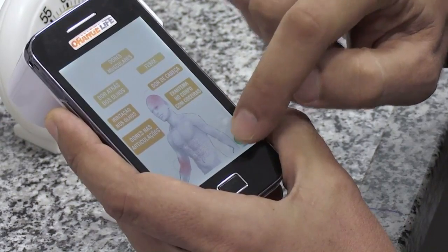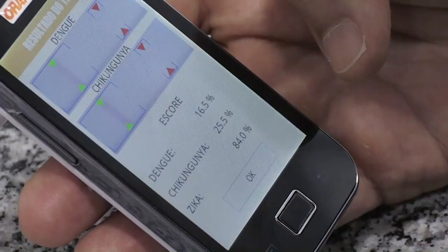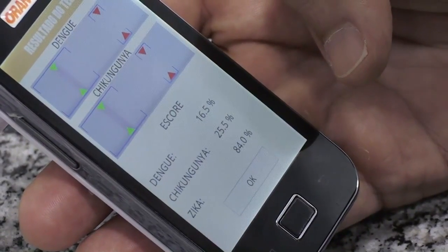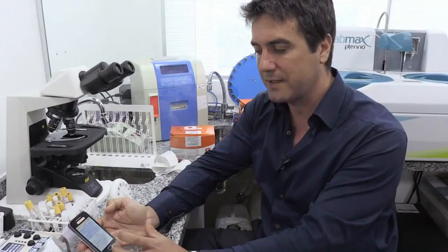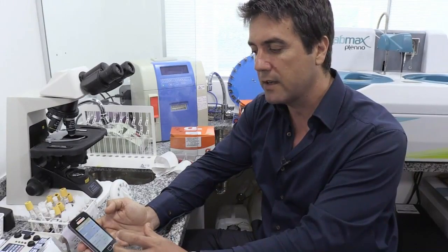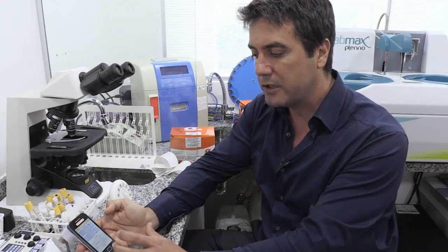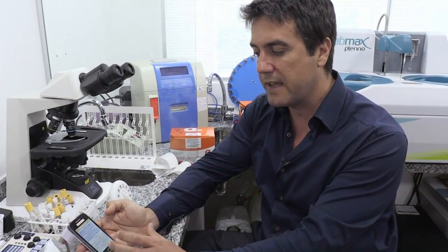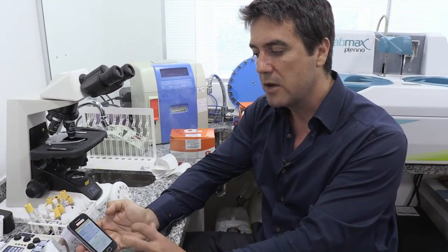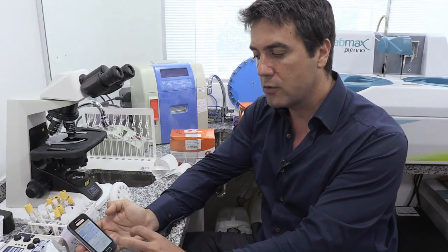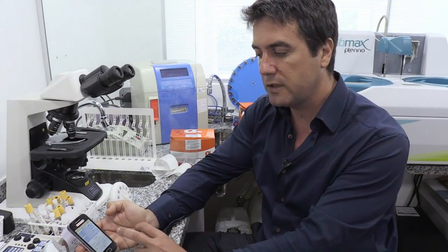And now it gives a final result. The patient has a 16.5% risk of having dengue, a 25.5% risk of having chikungunya, and an 84% risk of having Zika.